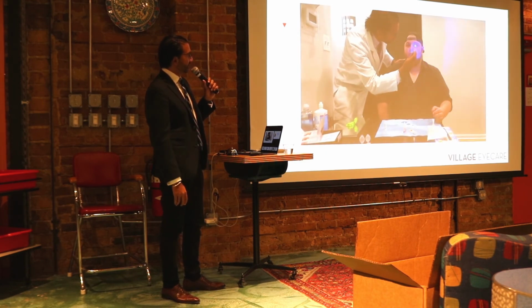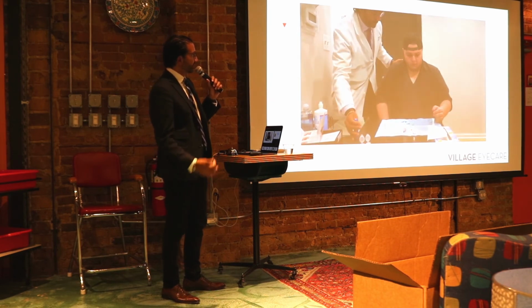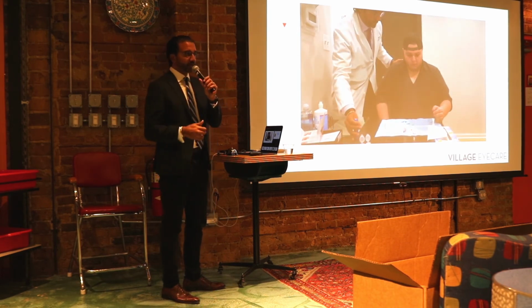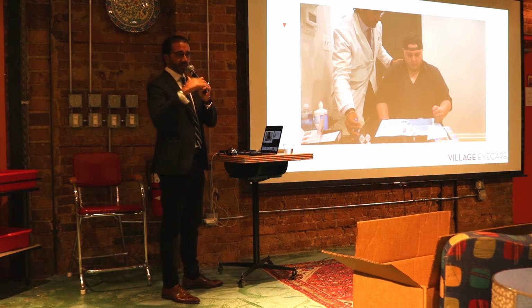I put the lens in, it's got fluorescein dye and saline. I'm checking for bubbles with the cobalt blue light. I'm also checking to make sure there's no apical bearing. If there was, I would take the lens off, go up 200 microns, and try another lens.